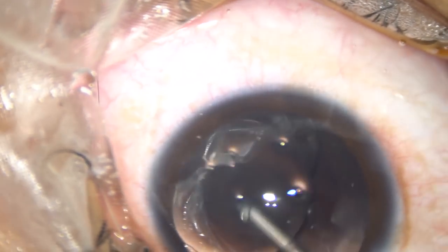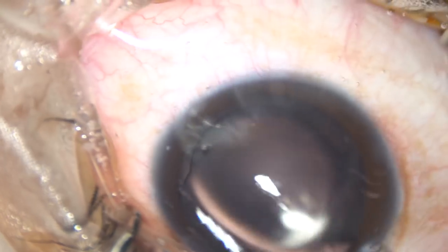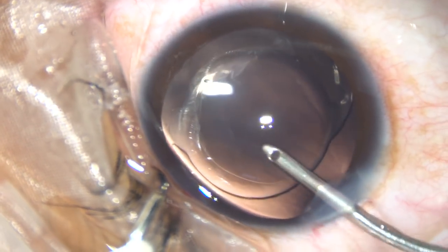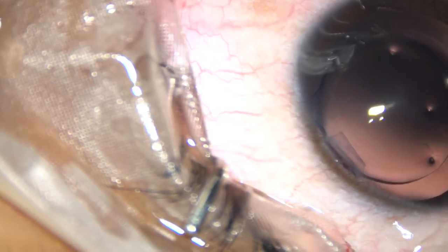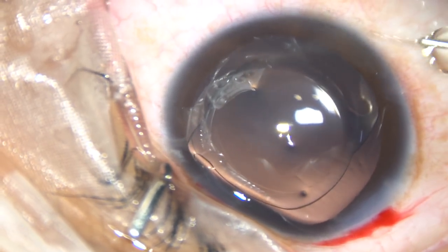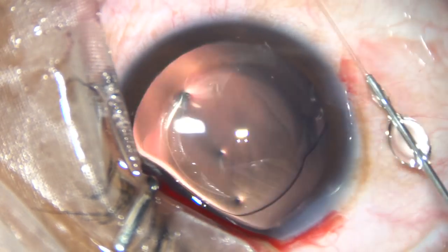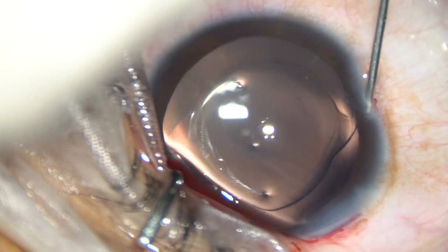And now the posterior capsule is being polished by the fluid jet. The anterior chamber is also thoroughly irrigated so that all the viscoelastic substance comes out. And now this is moxifloxacin. The side ports are closed by corneal stromal hydration on either side of these stab wounds.